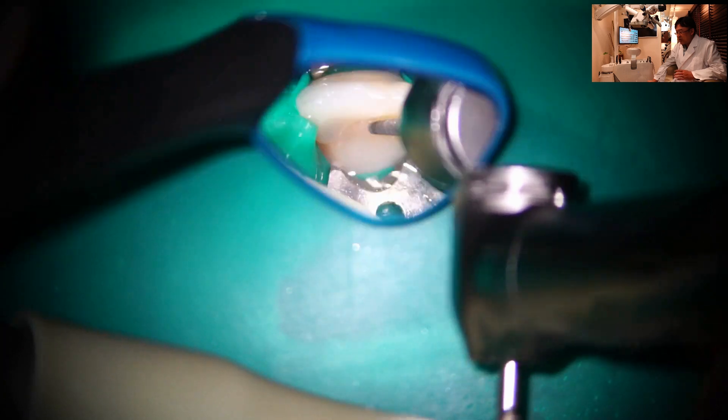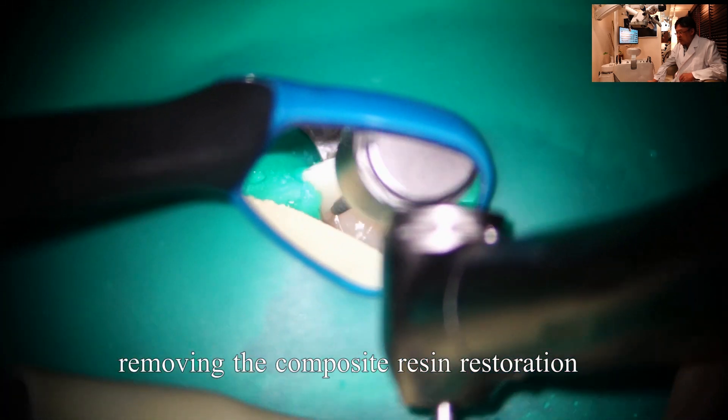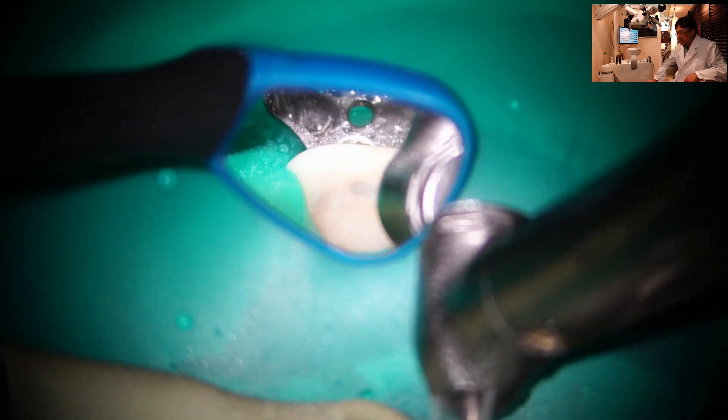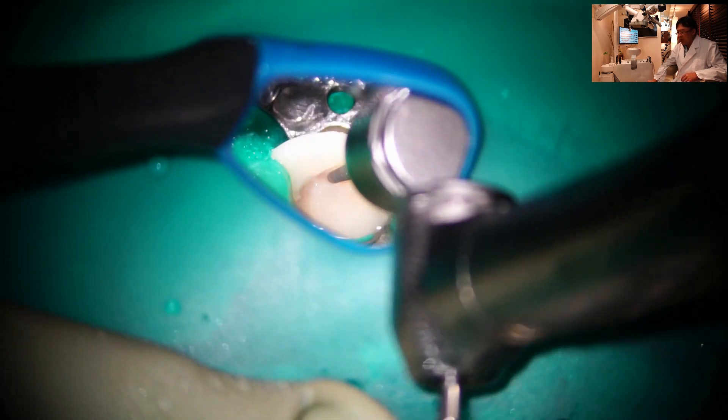First of all, I'm going to remove the restoration of the composite. I'm using a high-speed diamond bur to remove the composite.